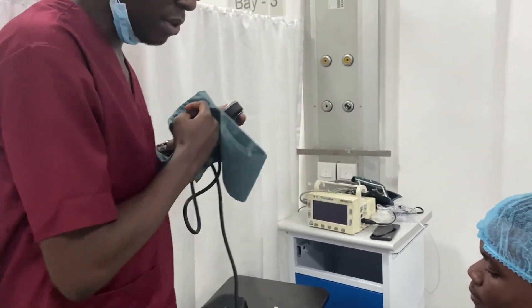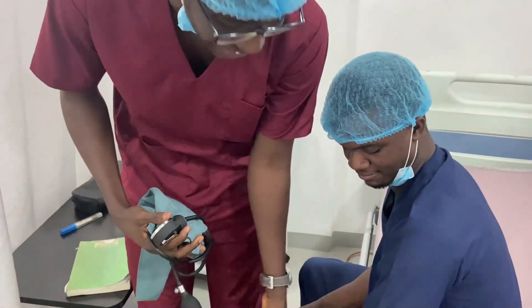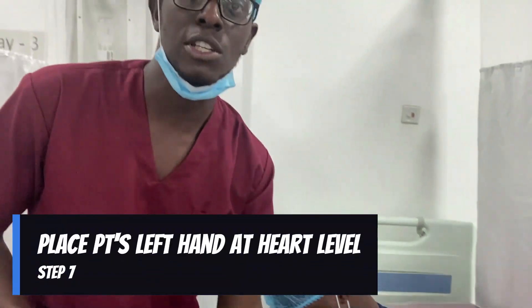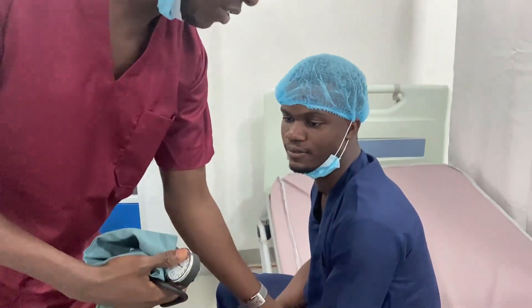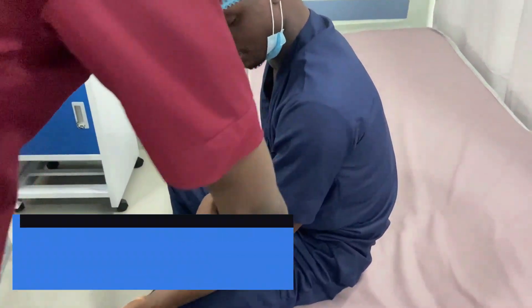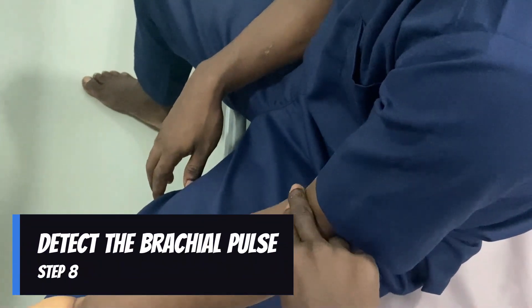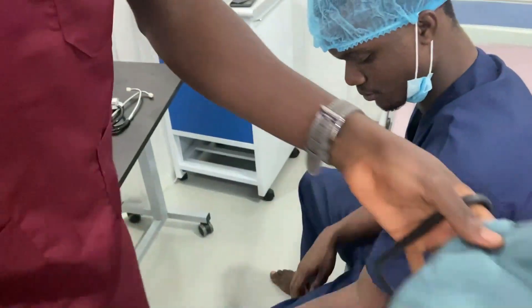Make sure your patient's left arm is at the level of his heart, because when the arm is lower than heart level, blood pressure tends to read higher than normal. Use your hand to detect the brachial pulse, and then tie the cuff around the arm.